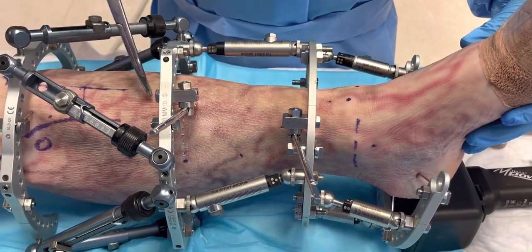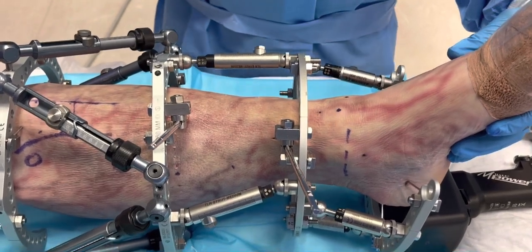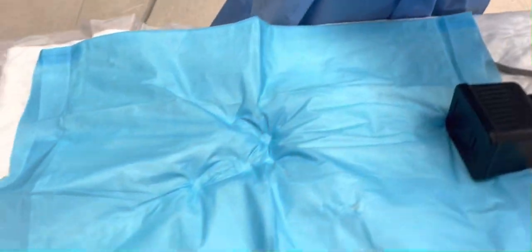Shortening distally with re-lengthening proximal. Now let's do this one — and now you have these four.